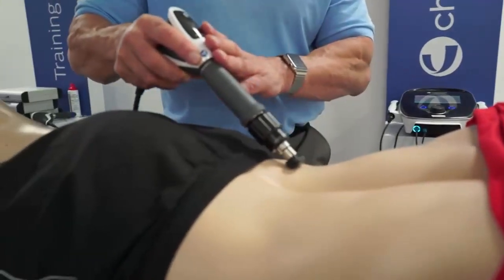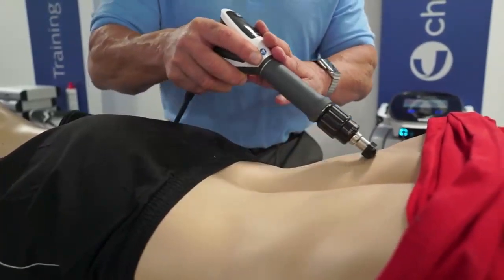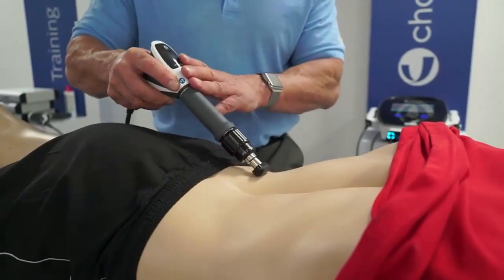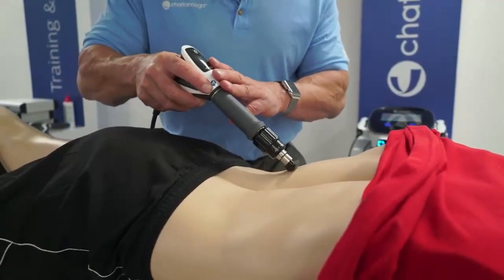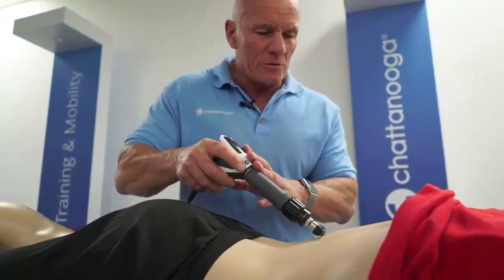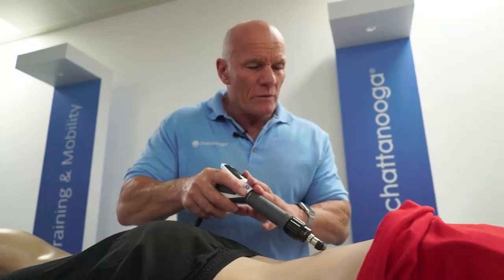So with our new compressor, we can use much lower bar pressures than were available to us on the previous version. And what we find is initially this gets stuck, and as we repeat our treatment, and we refer to these as tracks.